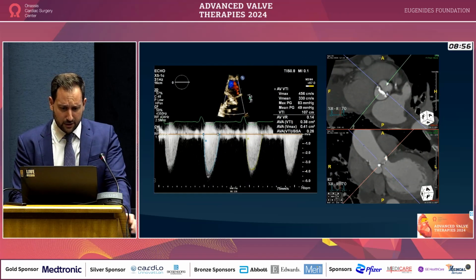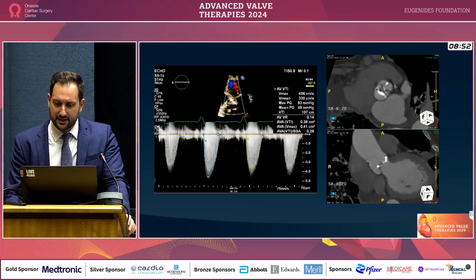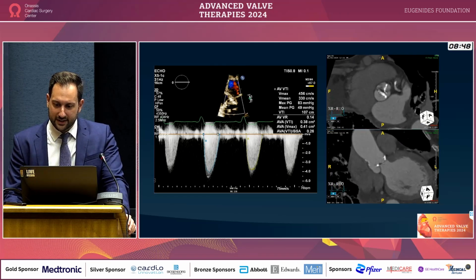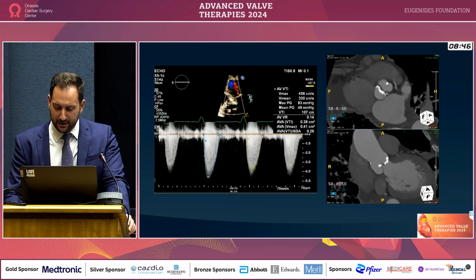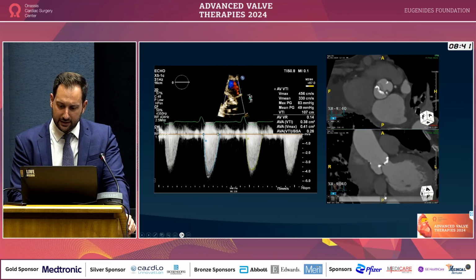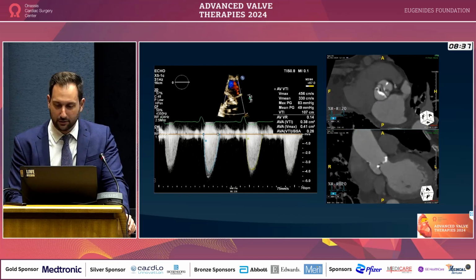So it's a very, very severe aortic stenosis. This is from the gated CTA. You can see it's a calcified valve. It looks more like type 1 Sievers with a calcified raphe there, and a very asymmetric non-coronary sinus, larger compared to the fused left and right coronary sinuses.